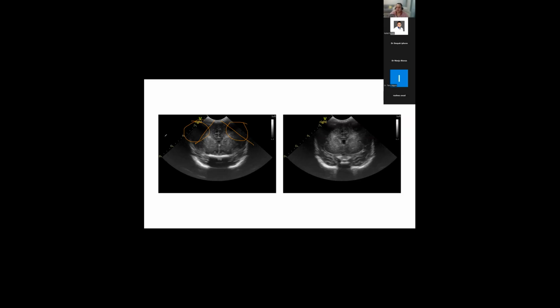Now, this is obviously a follow-up scan. Because this is a follow-up scan, I'm reassured that I've done a previous image, which captured the structures more frontally, and they actually look normal. But as I move back, what you'll see is the third image, where you have the cavum septum pellucidum and the ventricles starting to appear with the corpus callosum. And then you've got the temporal horns starting to appear over here with the interhemispheric fissure. So, kind of a proper third image.